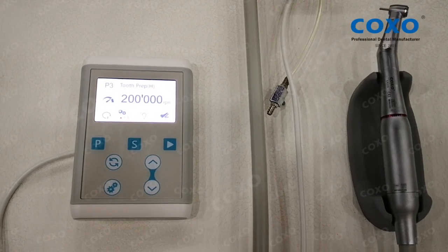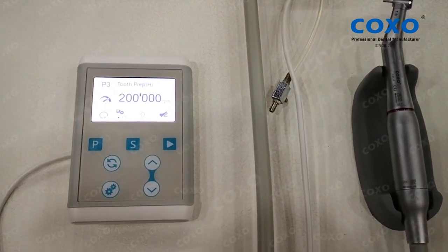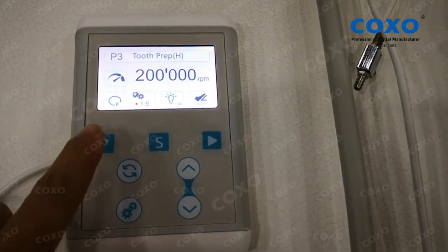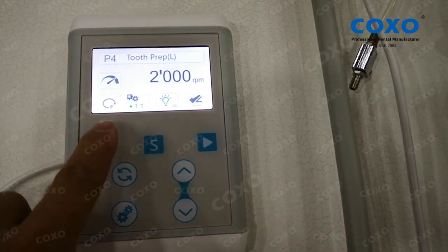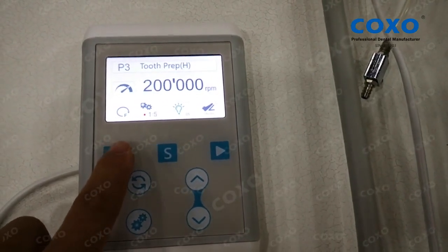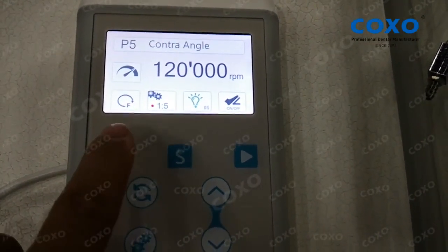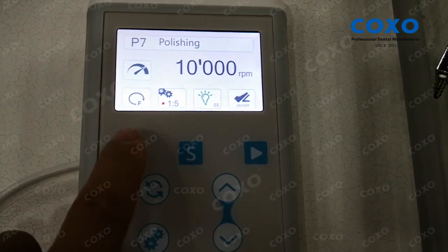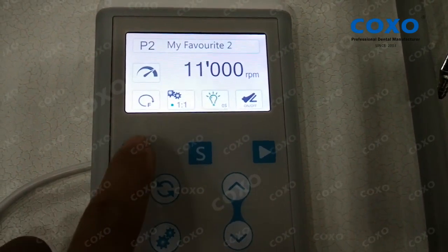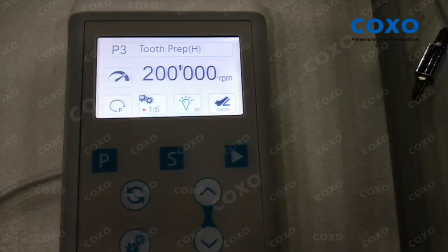Now let's see how to control CPUMA INT+. This button is used to control the program. You can choose different programs to prepare teeth, or use different contraangle or straight handpiece. And each one you can set the speed.